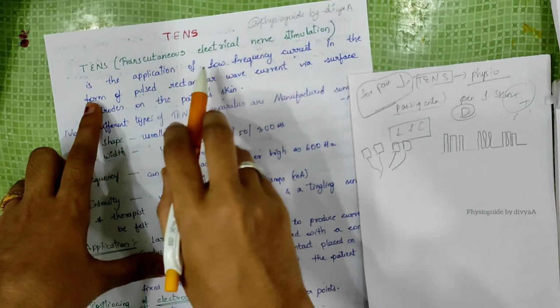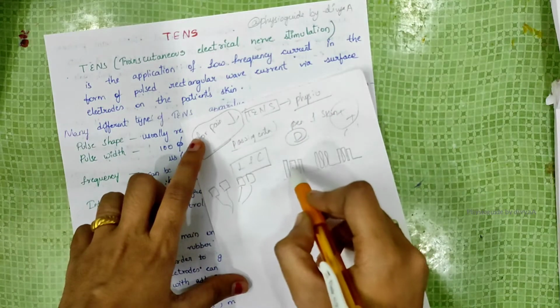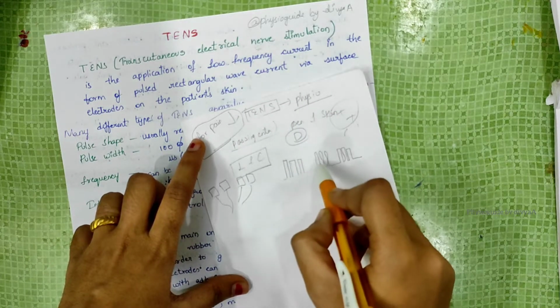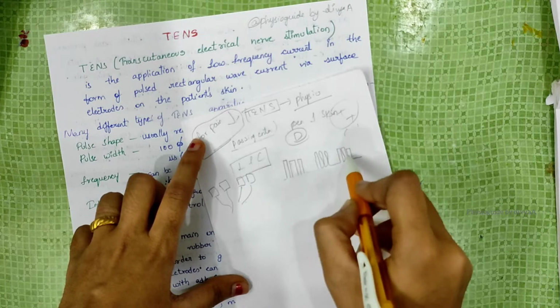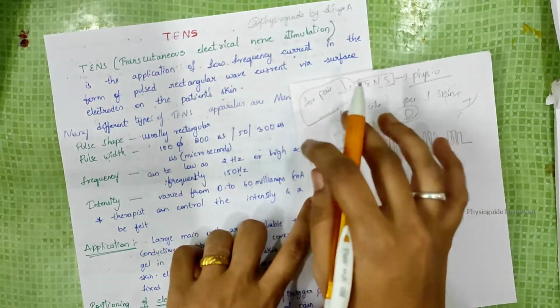So it is the application of low frequency current in the form of, as I have explained, pulsed rectangular wave current, where surface electrodes are placed on the patient's skin.